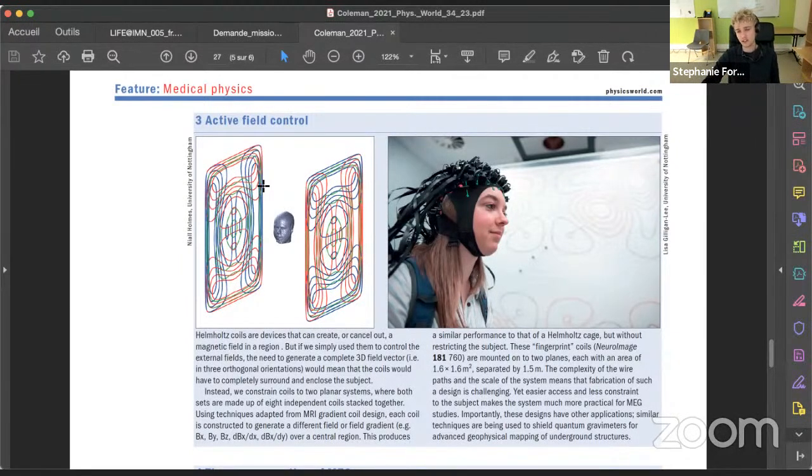But one of the great things with this new technology is that you can have a lot of detectors placed directly onto the head that move, in an ecological setting to do experiments. So the participant can move around and do stuff while wearing the new MEG machine. And because the head is moving, it's moving inside the magnetic field of the Earth. If it's turning like this or like that, it will change the magnetic field perceived by the sensors. So you have to actually remove this magnetic field, something you did not have to do when the machine was stationary.